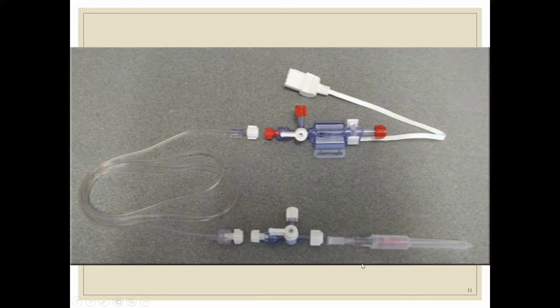So these are the various parts. This is the arterial catheter. This is the three-way or the sampling port. Then this is the tubing which is filled with saline. This is then connected to another sampling port, and this is the place where the transducer system resides. The transducer, which is a diaphragm and a Wheatstone bridge, has two inlets. One is for the saline filled tubing, and one is the wire which goes to the monitoring system.